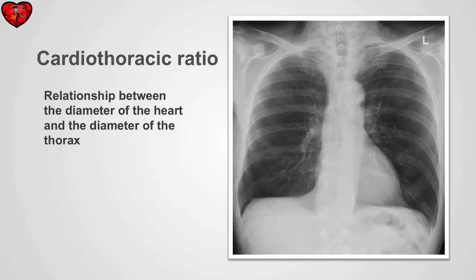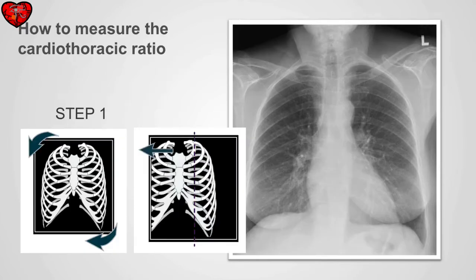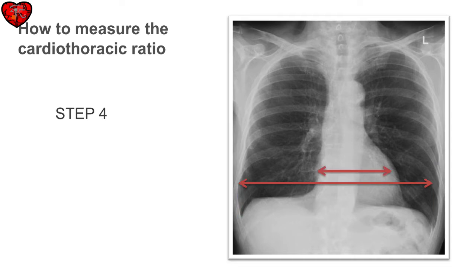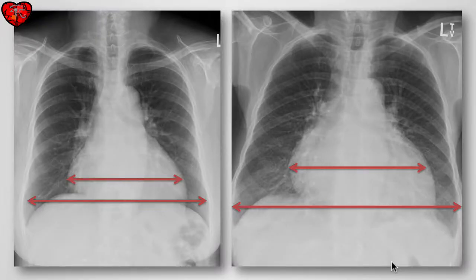When we talk about the size of the cardiopericardial silhouette, we usually talk about the cardiothoracic ratio — the relationship between the diameter of the heart and the diameter of the thorax. To measure it, first ensure the patient is properly centered and not rotated. Then measure the widest diameter of the cardiopericardial silhouette, and then the widest diameter of the thorax from left to right. The cardiothoracic ratio should be less than 50%.